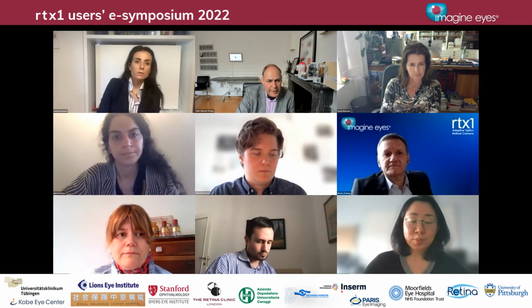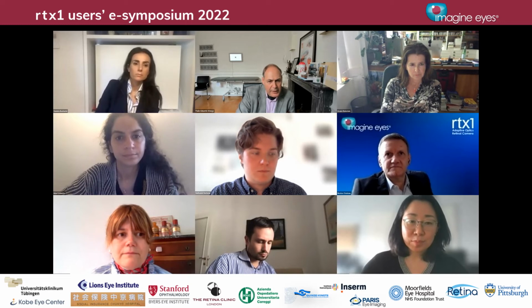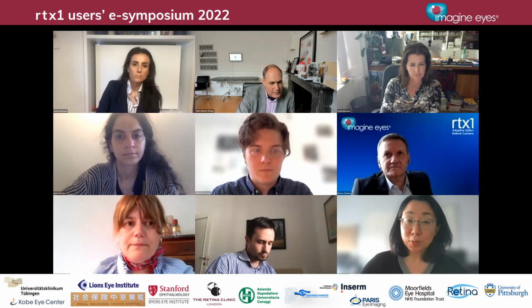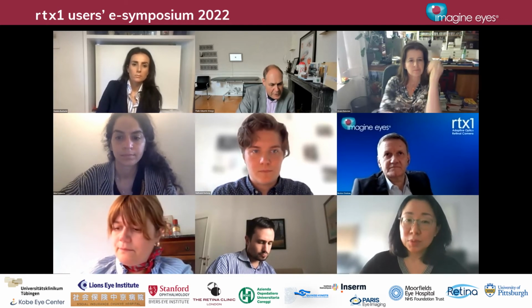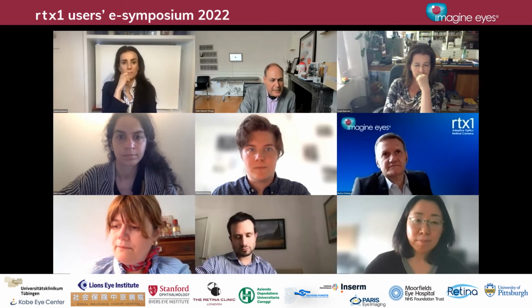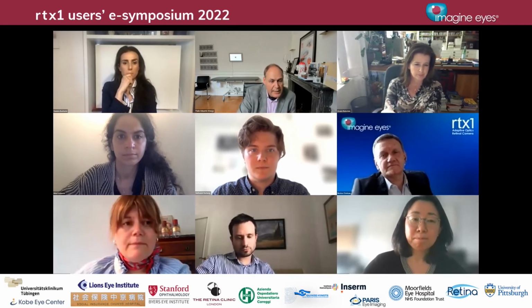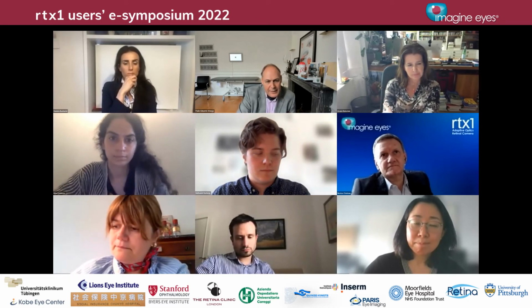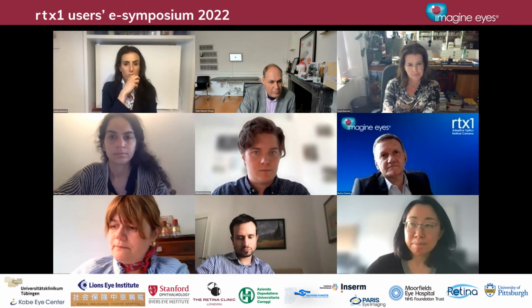One of the speakers, if I remember correctly, showed the hyperreflective dots in areas of GA. Is that correct? What I saw was in the border area. The border of the area of GA, yes, in the transition. Because we've seen them for years, for many years, with OCT, high resolution OCT in association with macular edema, for example, in vein occlusion.